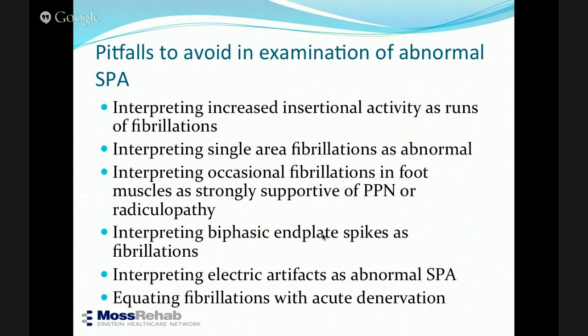Now, how do you differentiate between end plate spikes and fibrillations? That's an important thing to think about. Those who have done the EMG rotation can tell me that. Well, by repositioning the needle, everything goes away, even fibrillation goes away.